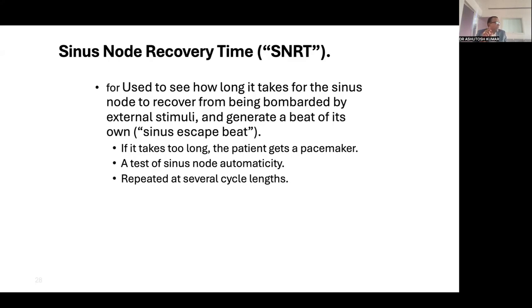We are pacing. The SA node is giving a beat of 60 beats per minute, say, and we start giving a beat of 100 beats per minute, making it silent. It is as if saying, I am working very hard. If it is a young or healthy SA node, the time we stop it, it will take a very short time to recover and start beating again at 60. But if it has grown older or is diseased, it will be sleeping because it is not in a state to recover very fast. That is the sinus nodal recovery time. The older the SA node, the more diseased, the more time it will take to recover. The same thing we do in the EP study.